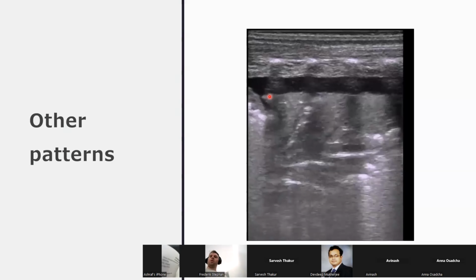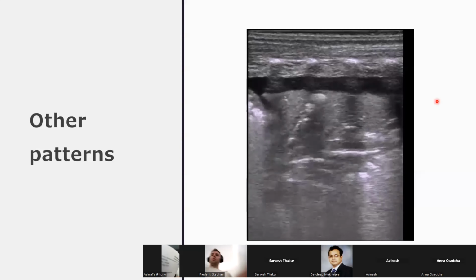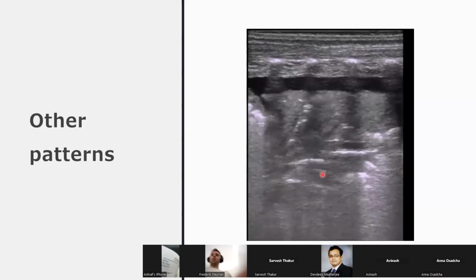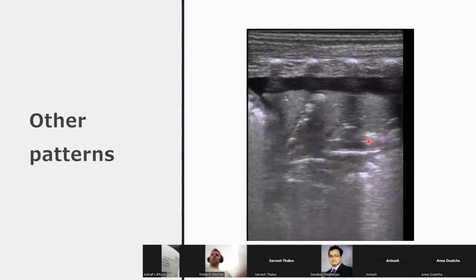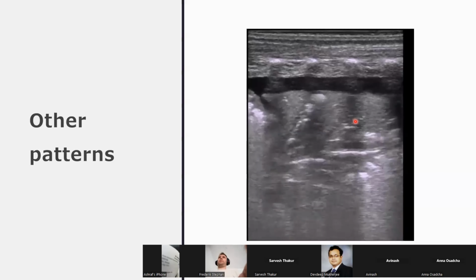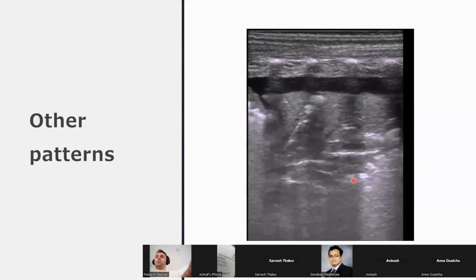And also the borders, what area of the. So it's very geometrical. I agree. It's kind of very geometrical. And then what else? And if we put the Doppler. Okay, we put Doppler on it. Nothing stood out. But what about these? What are these?